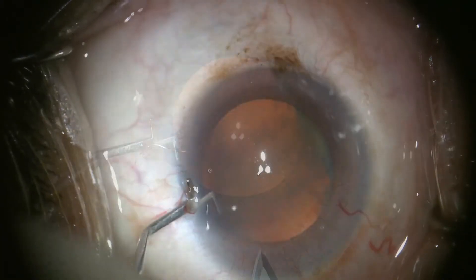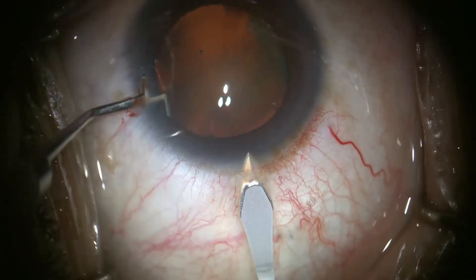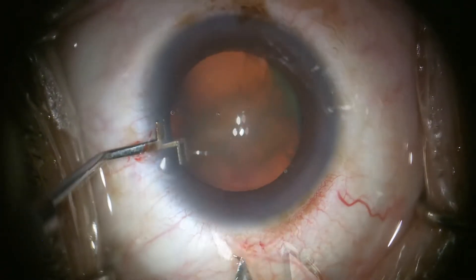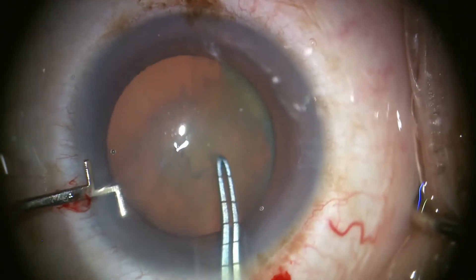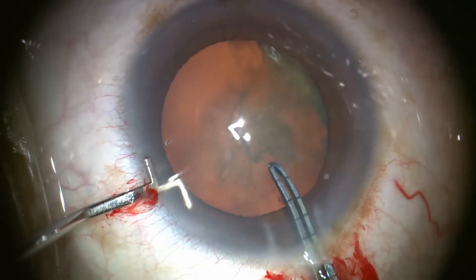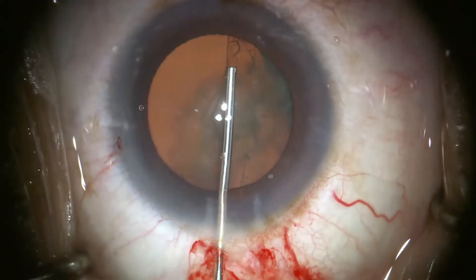I use a Stamler or Ogawa-Stamler hook for globe stabilization while creating a corneal-scleral main incision with a very sharp 2.2mm steel keratome. The corneal groove is incised to minimize ballooning. The capsulorhexis is begun with a bent needle cystotome, then Jones-Inomoto forceps with millimeter marks are used to measure for appropriate sizing while continuing and completing the capsular rhexis.